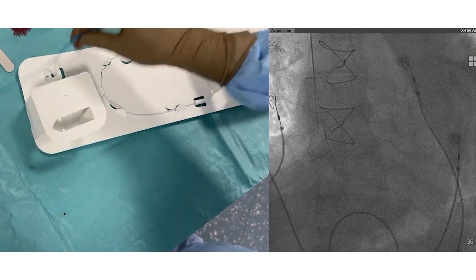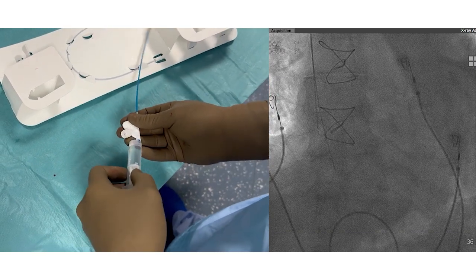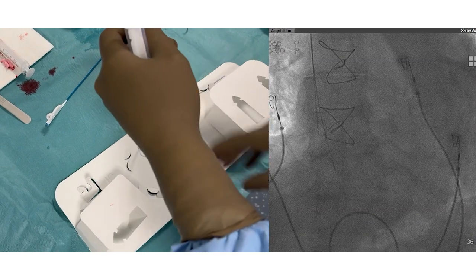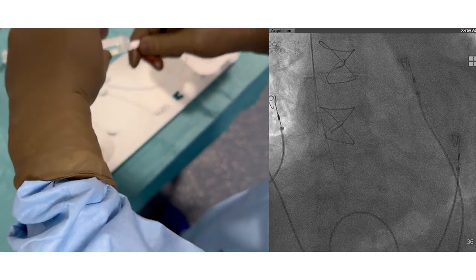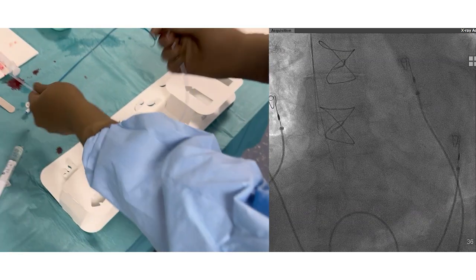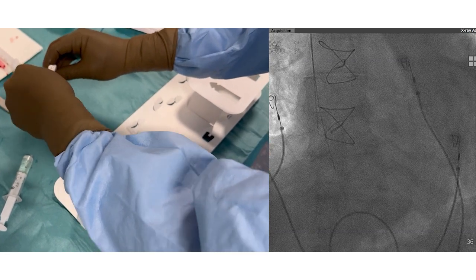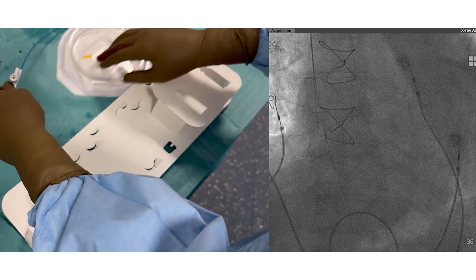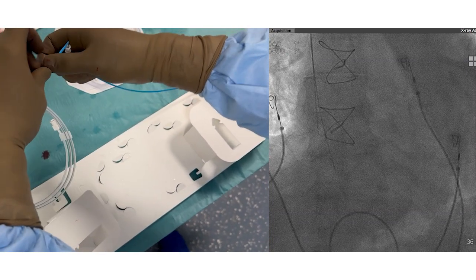In this video we will show you how to perform left bundle branch area pacing in a patient requiring His-bundle ablation. A popular approach is with the C315 His guiding catheter, which is a non-deflectable guiding catheter with 7 French exterior diameter and is 43 centimeters in length. It is used to deliver the 3830 Select Secure pacing lead, also from Medtronic.